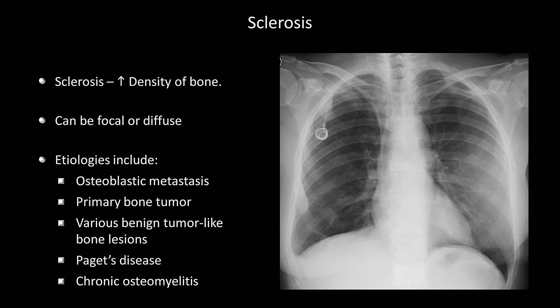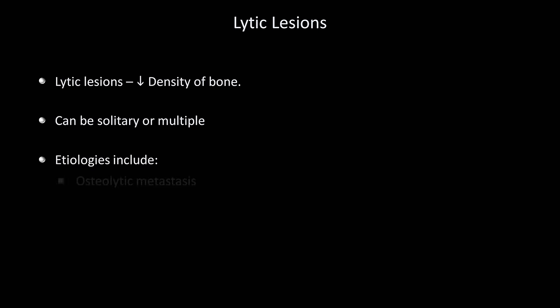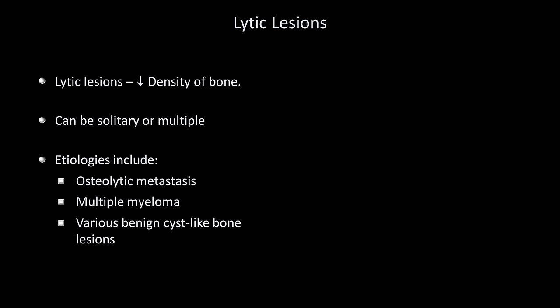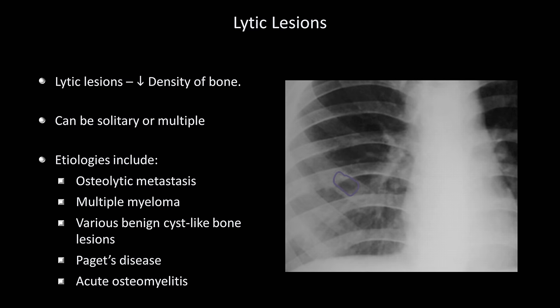This case is a little unusual in that bone mets in breast cancer are usually osteolytic and not osteoblastic, as seen here. Which brings us to lytic lesions — areas of bone where density is lower than normal. They can be solitary or multiple, with etiologies analogous to sclerotic lesions: osteolytic mets, multiple myeloma, various benign cyst-like bone lesions, Paget's disease, and acute osteomyelitis. The differential varies greatly depending upon patient age. Here's an example of a lytic rib lesion, which in this case was due to tuberculosis.